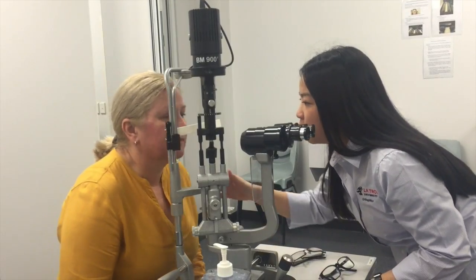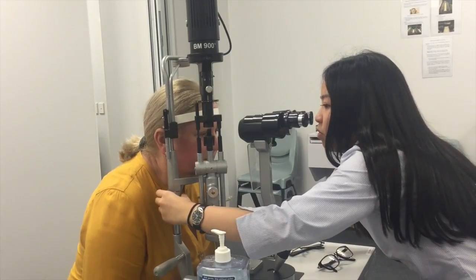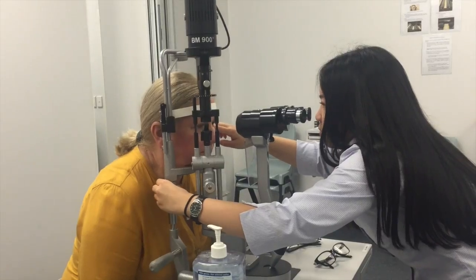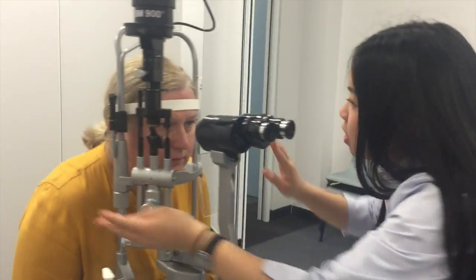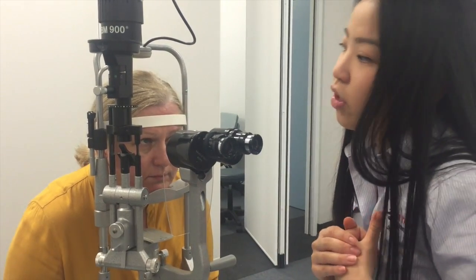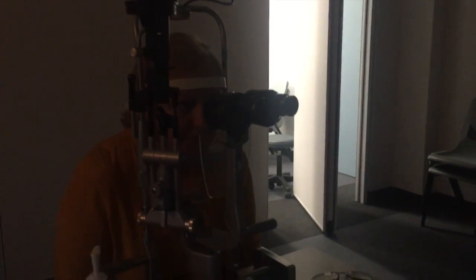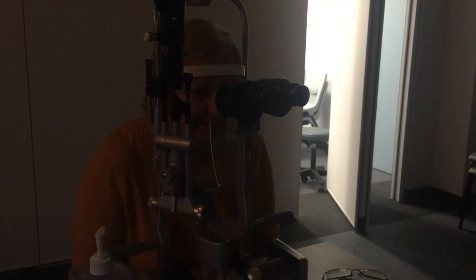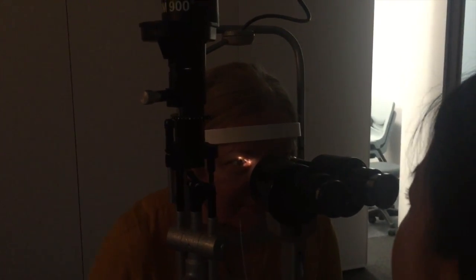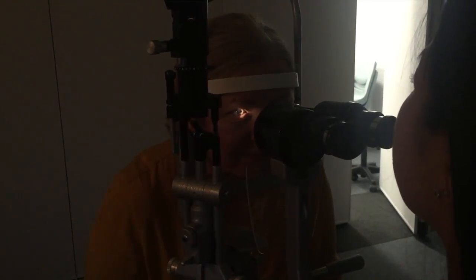So I'm just going to align you. I'll get you to come forward a little bit and I'm just going to move this up a little bit here. Are you comfortable there? I'm just going to move this higher up so we've got alignment here. So the test won't hurt at all — all there will be is a light shining in your eye. I'll just turn off the room light now. I'll just get you to look over at my ear. Just looking at my ear.